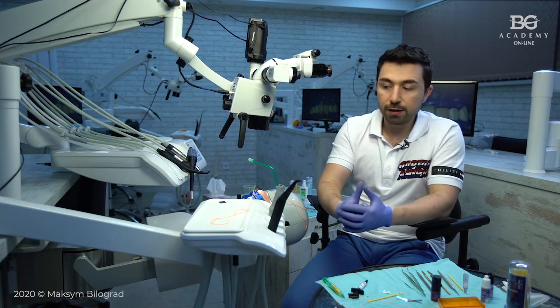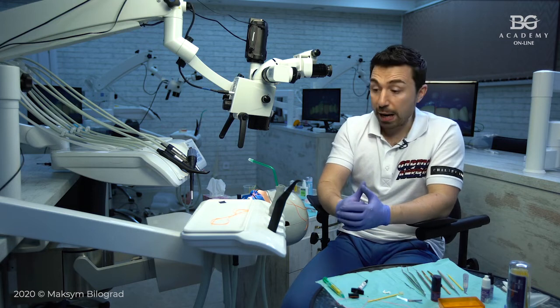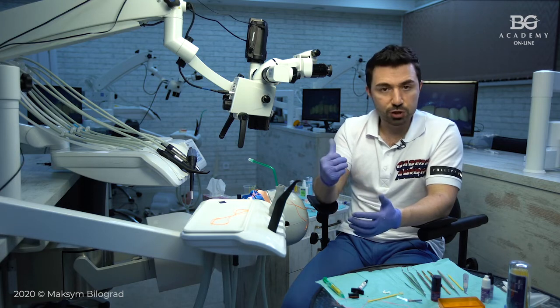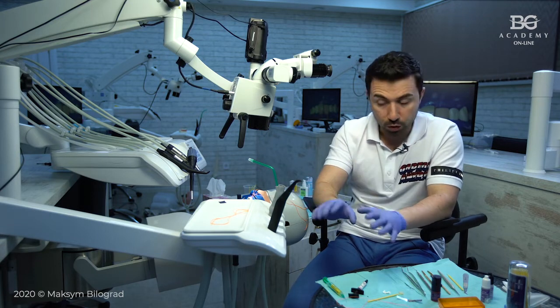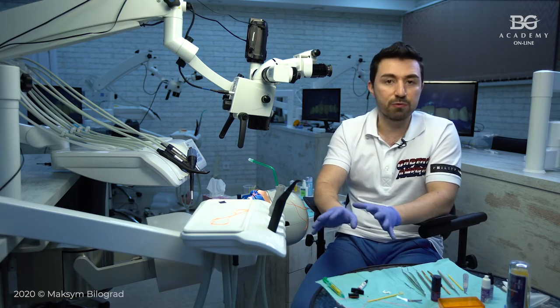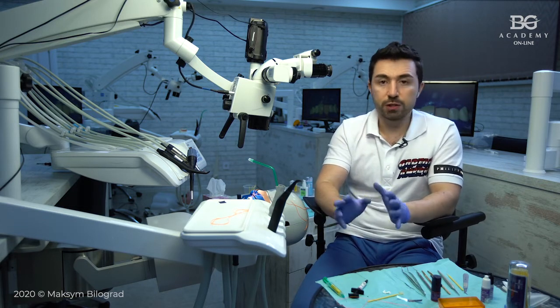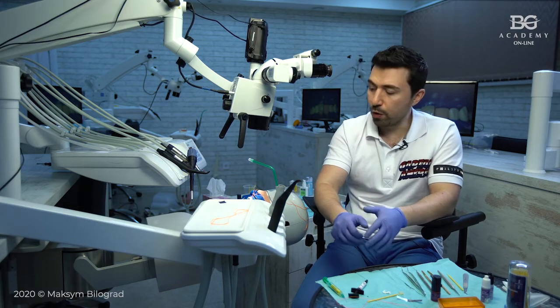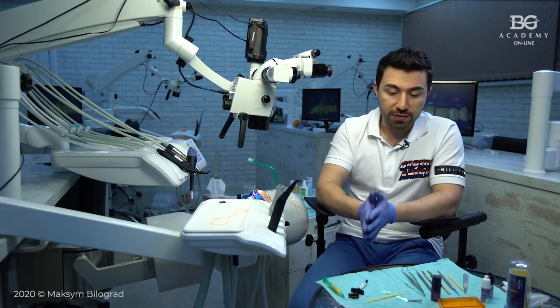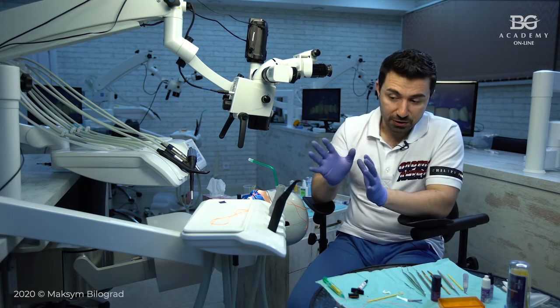We will take 3 different types of preparations: a molar tooth for type 1, and premolars for type 2 and type 3 veneer preparations, step by step live, with deep explanations, with everything as this time.